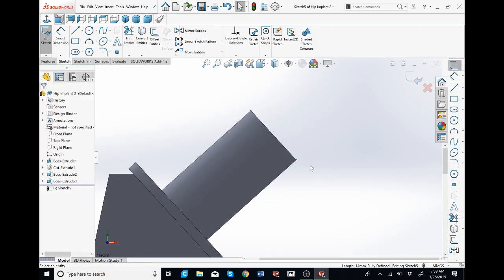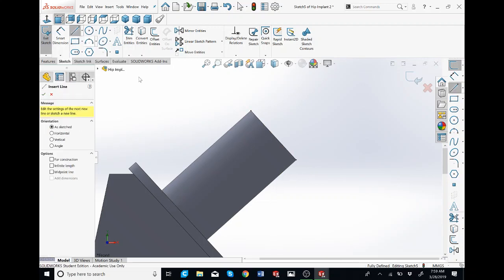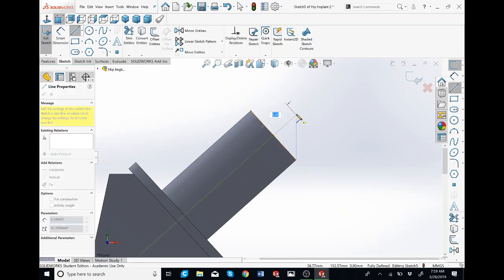So the center line isn't used for the sketch, it's used as a reference. I'm going to create an actual line. You can click on this or press L. I'm going to hover over, and I want to be at the center of it. So click on this. You see that there's a yellow dot line because I want to make it perpendicular to the line I just created. So I'm just going to attach it there.